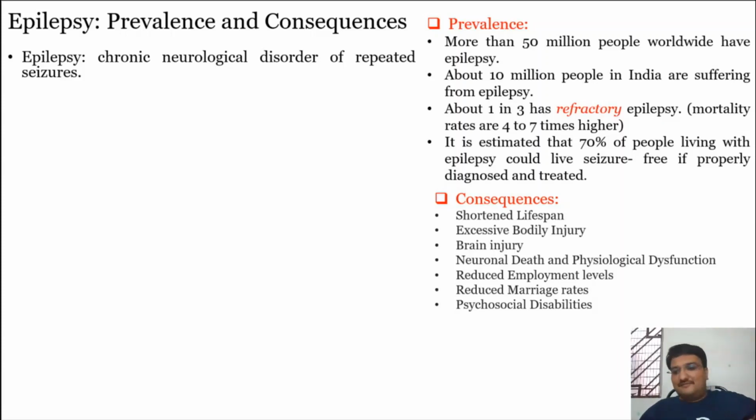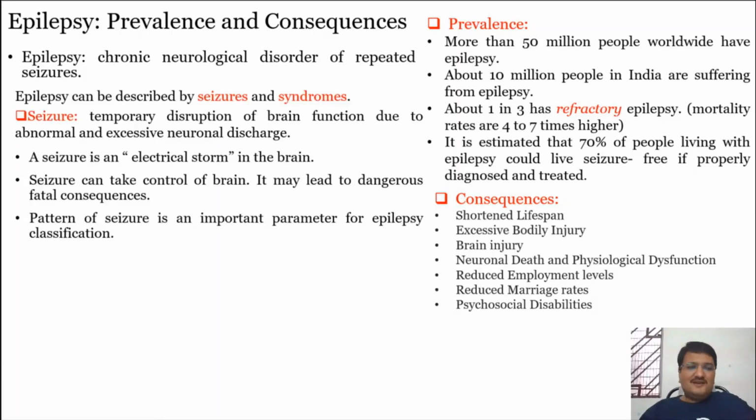So, how do we detect epilepsy? How does a neurophysiologist or neurologist approach any epileptic patient? I already mentioned that at the initial level, EEG would be advised, and then the traces or final data stream would be observed, and an impression would be provided to the affected subject. But if I talk in detail, epilepsy can be described by two things.